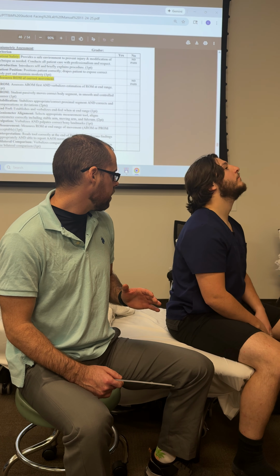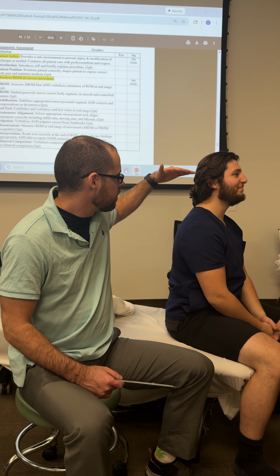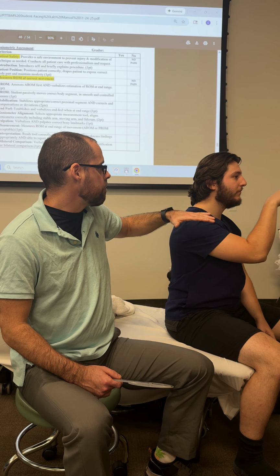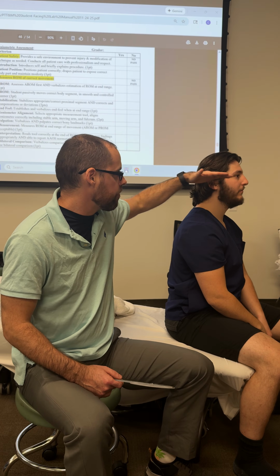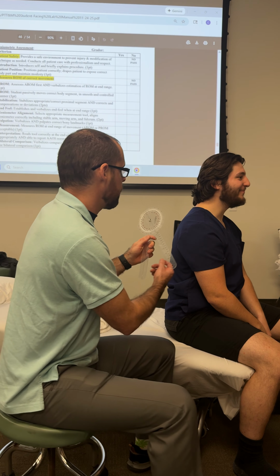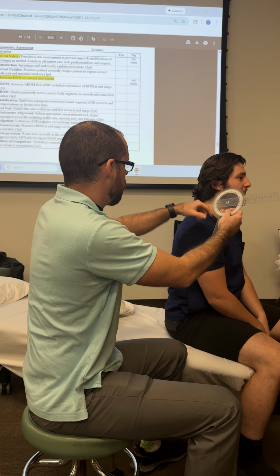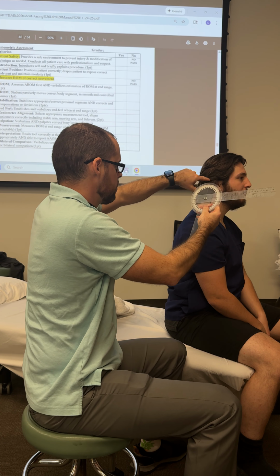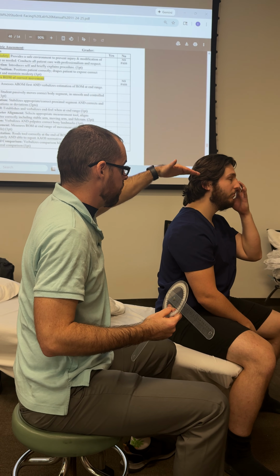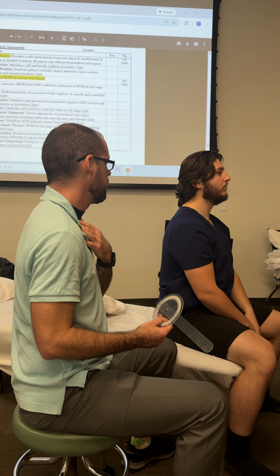And then we are following parallel to the inferior line of the nose, basically. Some patients' noses are a little off, so I would just think of it as following the midline as much as we can. But similar to doing it from the front, I'm going to have to move my axis to make sure it's where the axis is, because it's the angle of the head and the nose to the floor that really tells me how much flexion or extension is occurring.